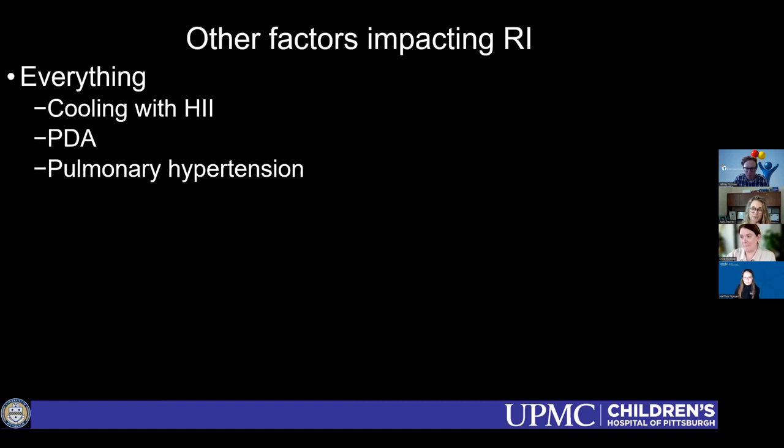We don't bill for it. Okay. You're exactly right. If it's color or power Doppler or microvascular imaging, there's no charge. But if you throw a spectral on there, theoretically you could charge.